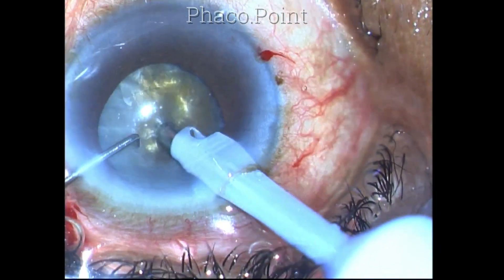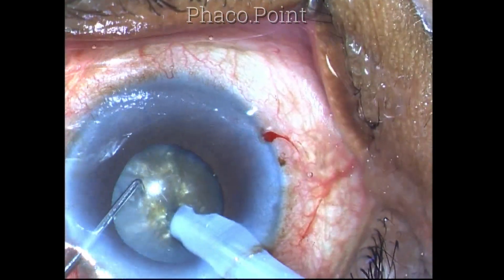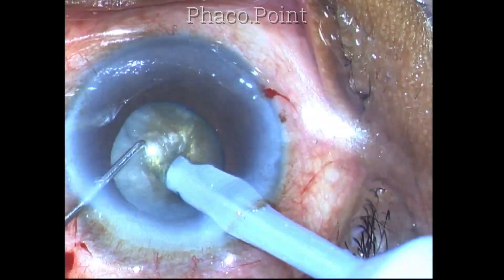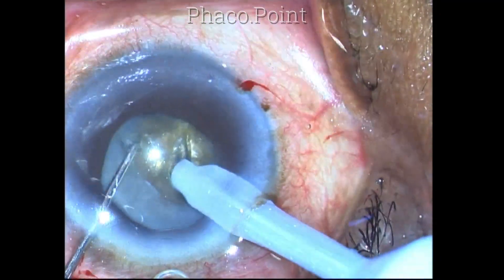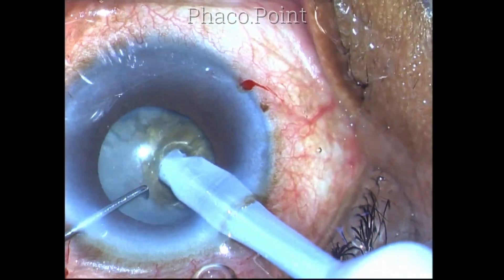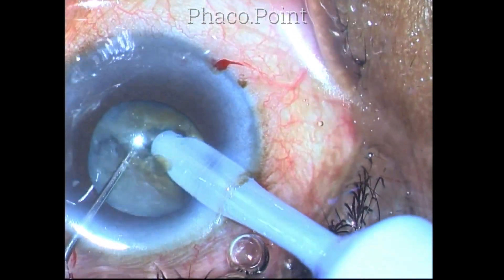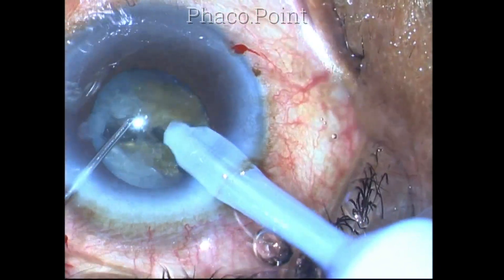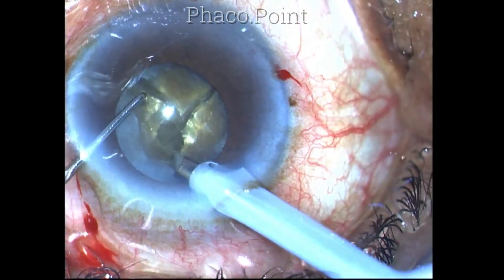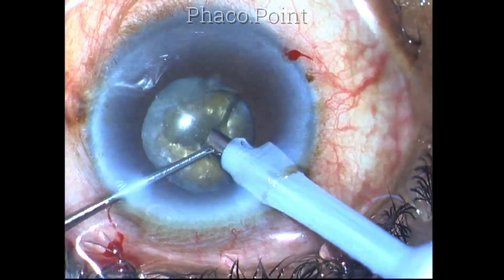The first chop has not gone through and through. I succeed only in cracking the superficial part of the lens. I then realized this cataract is much harder than I anticipated. In order to get a proper hold, I need to bury the tip deep into the substance of the nucleus. Once I have buried it to sufficient depth and I'm able to hold the lens with a certain amount of suction, then it's easy to crack this nucleus.